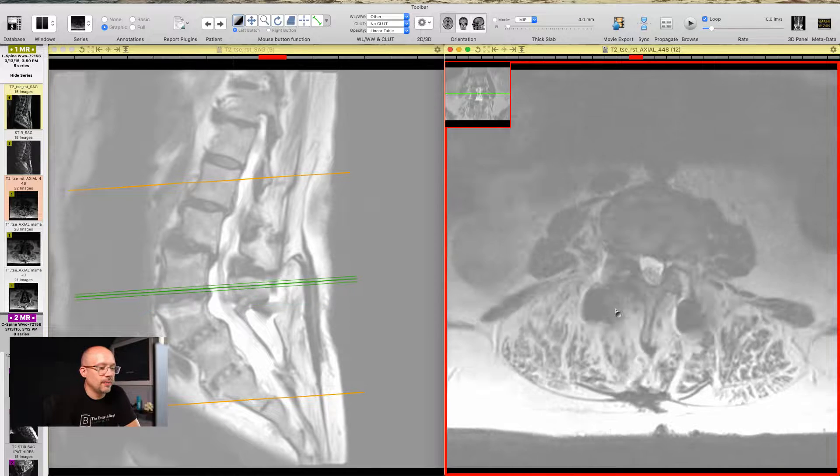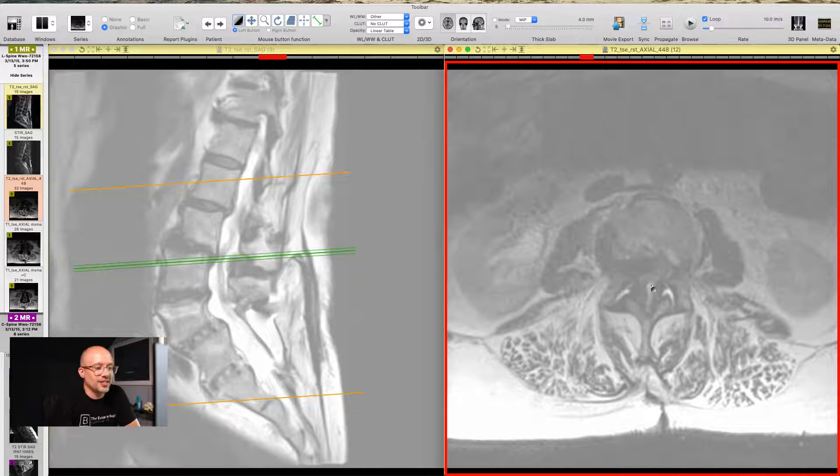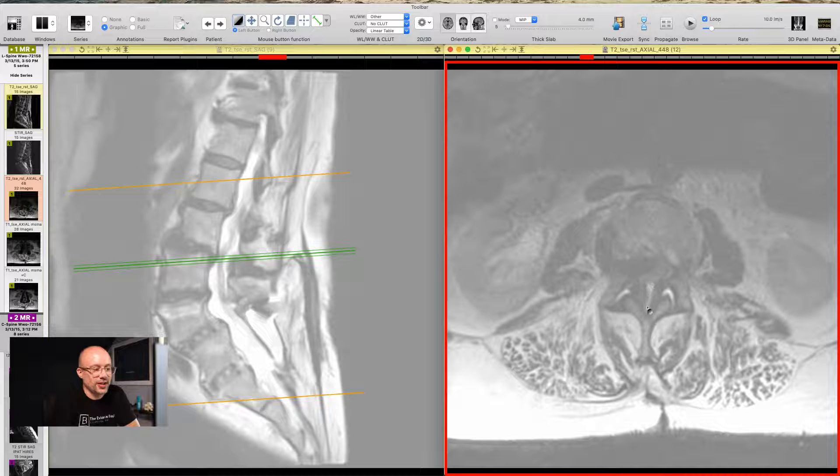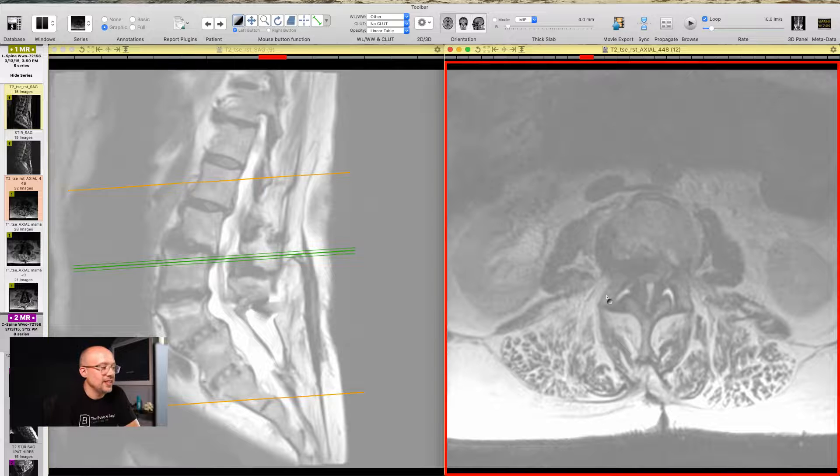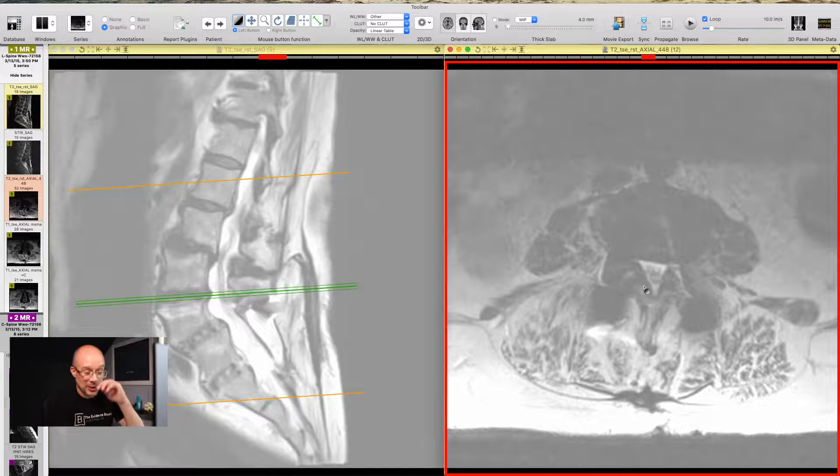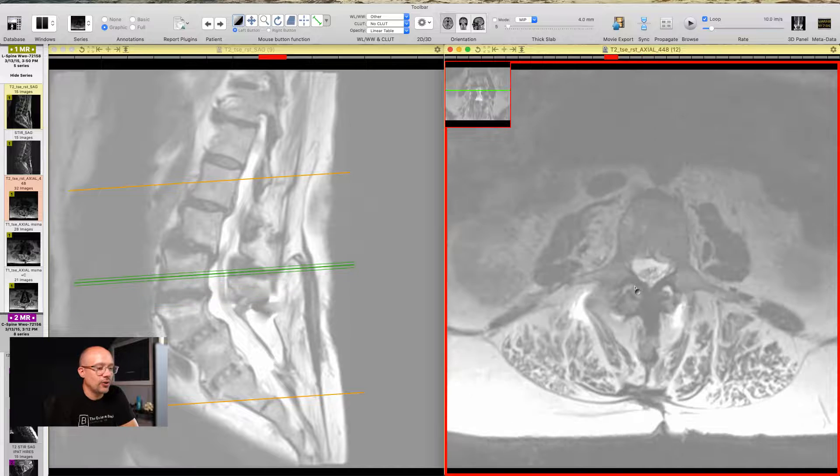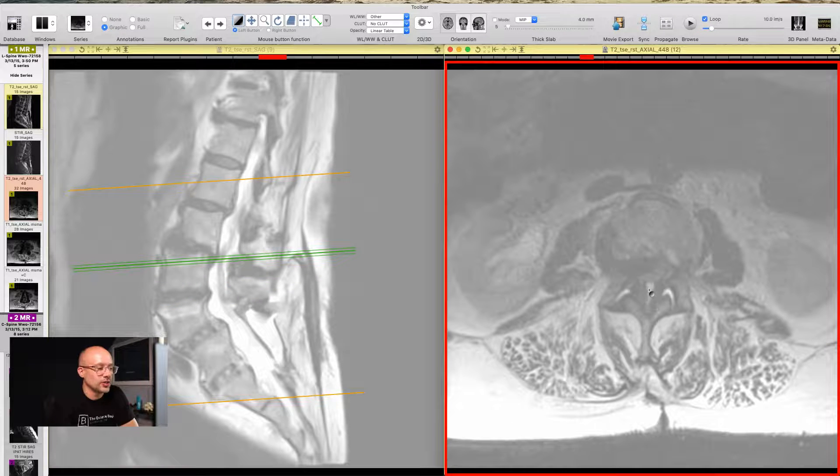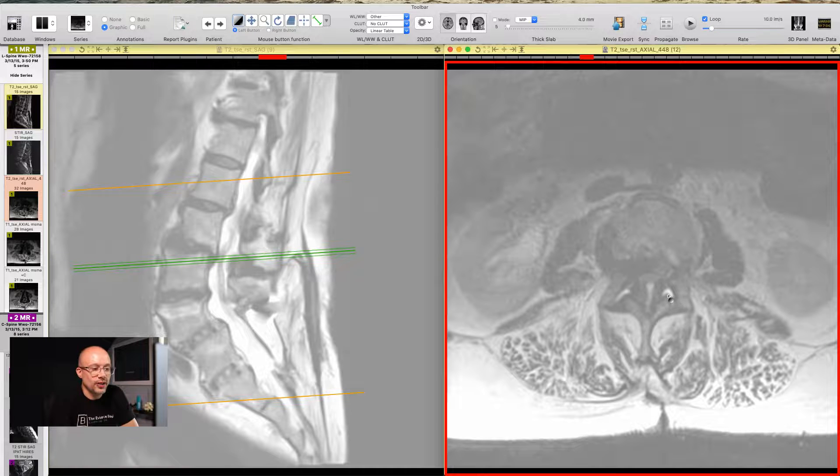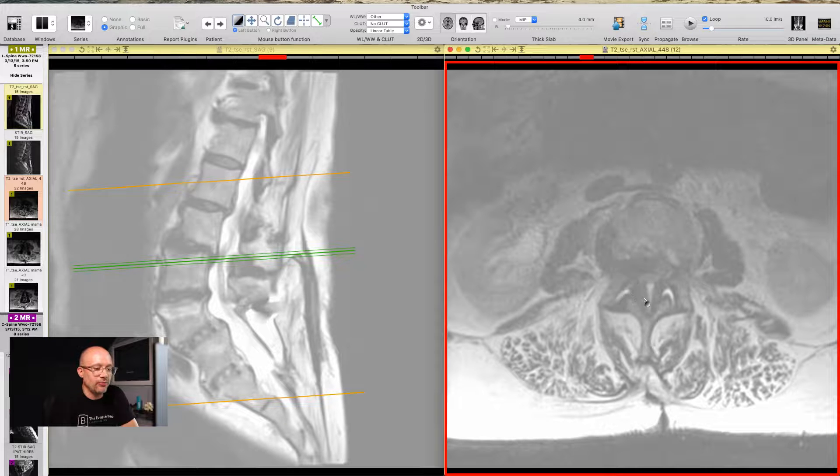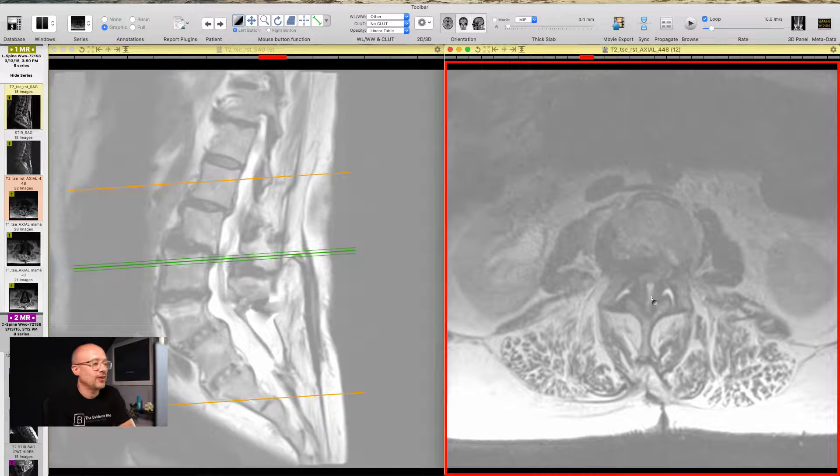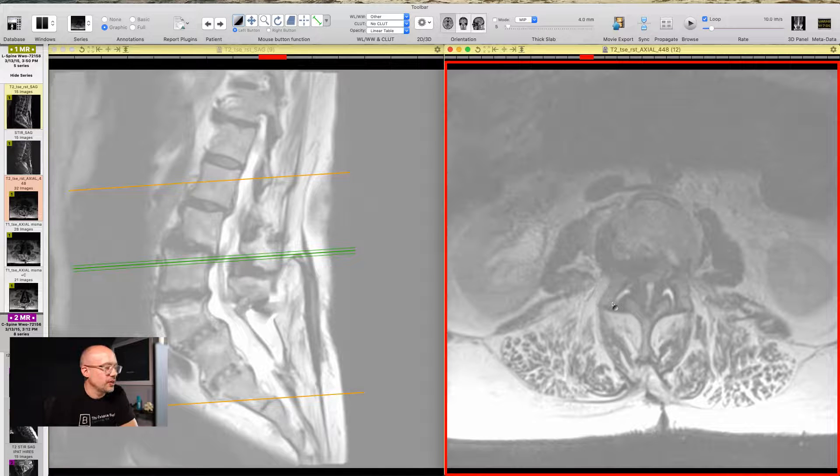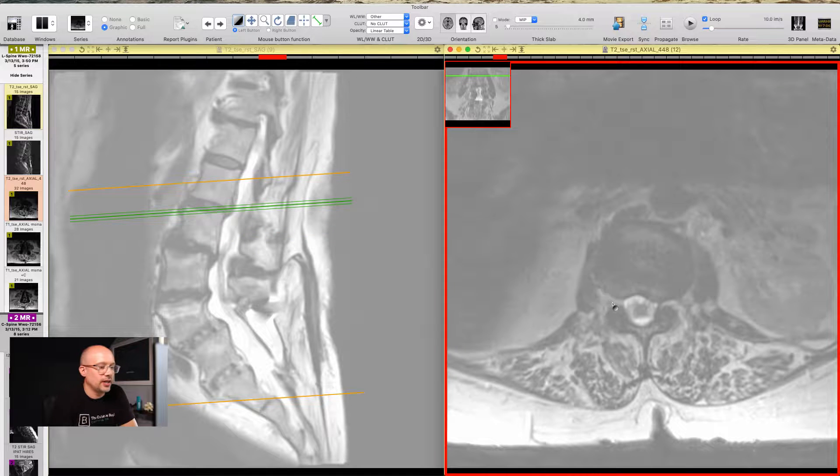Let's keep on going up as we go up towards L2-L3. We see severely stenotic. Look at that little tiny area that I'm highlighting that is left of the spinal canal or spinal cord. Even compared to the level below, that looks a lot bigger and healthier. To me, we could measure it, but I can just see it visually. That is much more healthy. It's probably moderately stenotic at L3-L4, but there is severe spinal cord stenosis at L2-L3. Additionally, we see fluid in the facets, those little white streaks. That's fluid in the facet joints. And we see that big black V right here is a ligamentum flavum. That's a ligament that sits inside of the spinal canal that's very thick and hypertrophic. It's causing a lot of challenges for this individual. So really, really stenotic as we get up towards L1-L2.